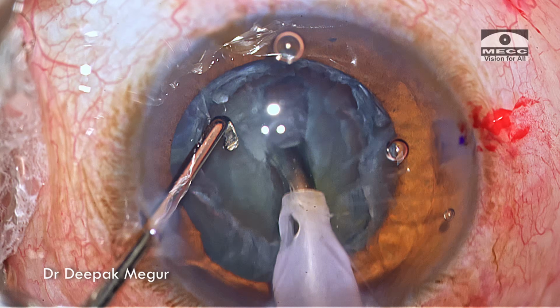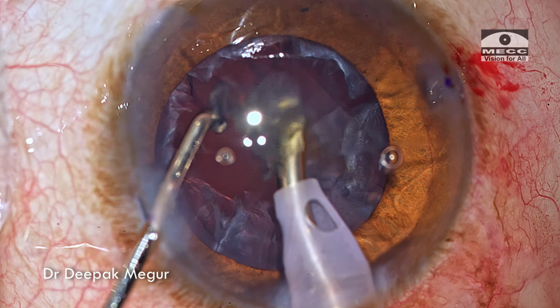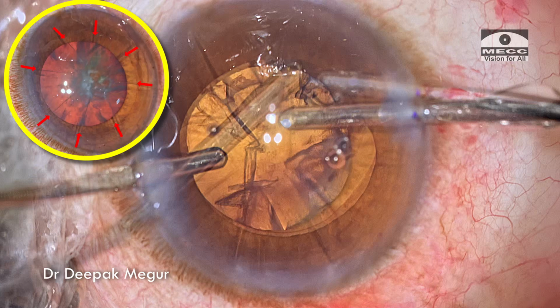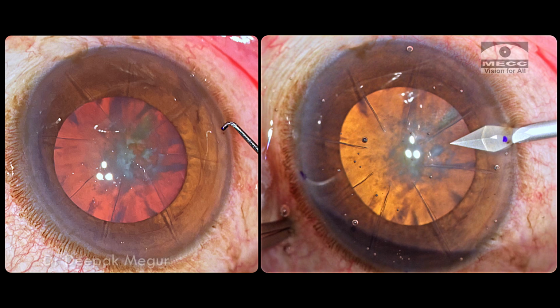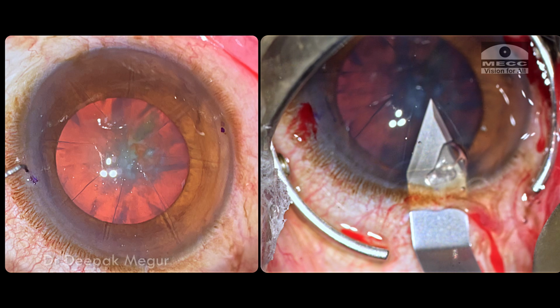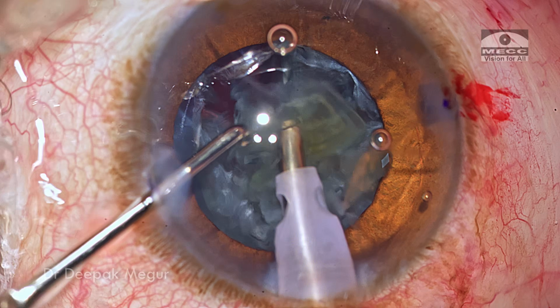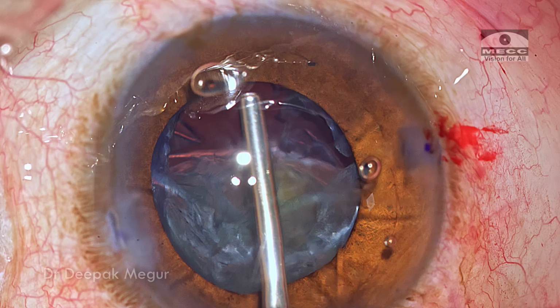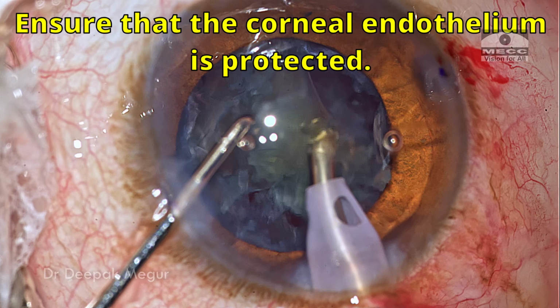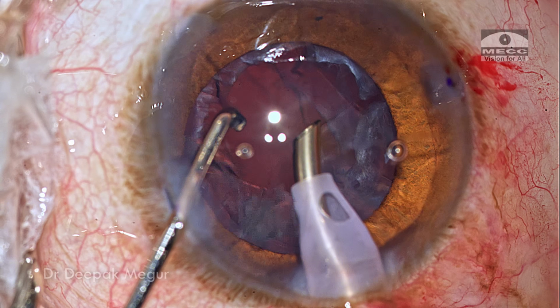So I would prefer to perform a low pressure surgery in eyes that have undergone radial keratotomy. This helps in preventing these cuts from opening up. It's also important to plan our incisions in such a way that they are exactly in between these two cut areas. And of course, the other precautions which we take for any routine surgery, like ensuring that the corneal endothelium is protected, have to be carried out in this case as well.